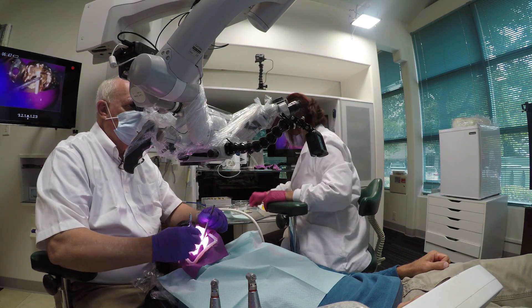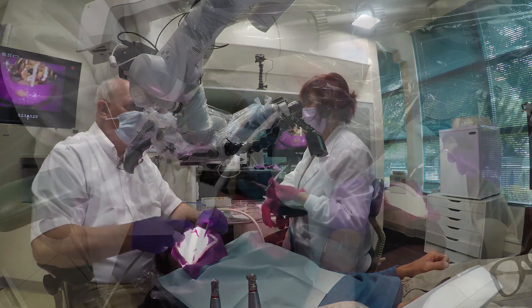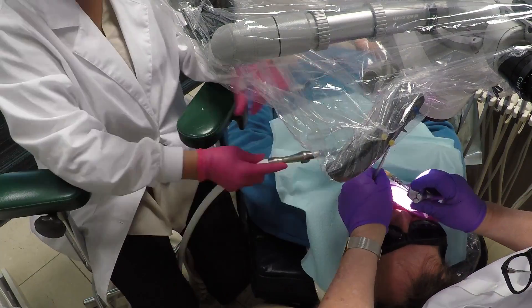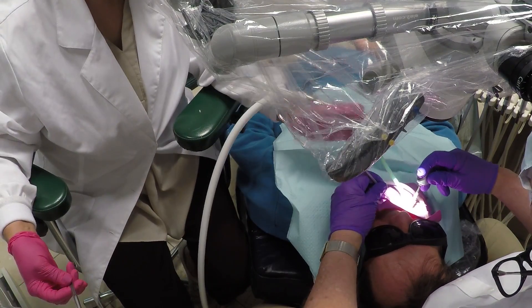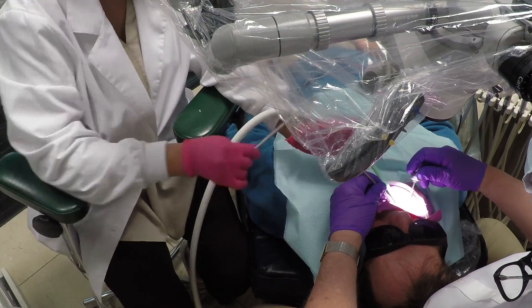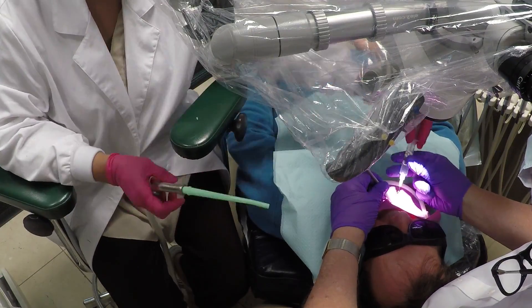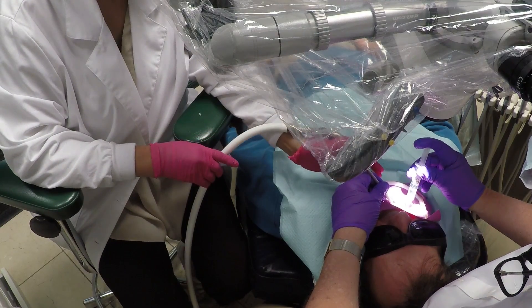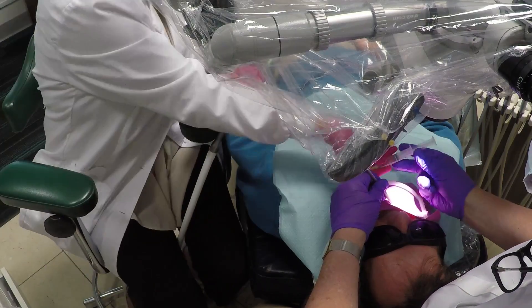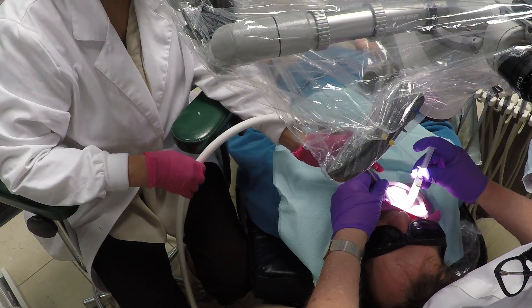So here we are. I'm going in with the paper points, back and forth to the air. There's the normal air and water, and then I'll go to the air-only, drying it off. Joy is changing my mirrors. Here we are — I'm using a rinse with bleach and then alcohol. There's the alcohol.